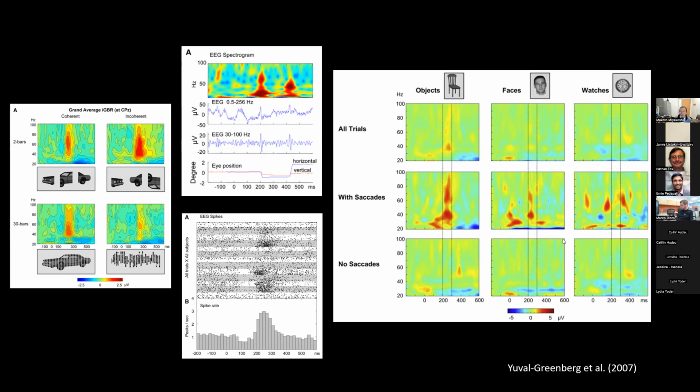But Yuval Greenberg showed that this gamma oscillation is basically saccade. This is from the eyes. Remember, a professor in the 1970s said, no, this is from the eyes, which was refuted later. But Yuval Greenberg showed that probably in most cognitive laboratory experiments using humans, if you see something like this, this gamma band oscillation seems to be related to how this car image is chopped up. If this is flipped, then even stronger gamma. So it suggests as if this is a cognitive process.